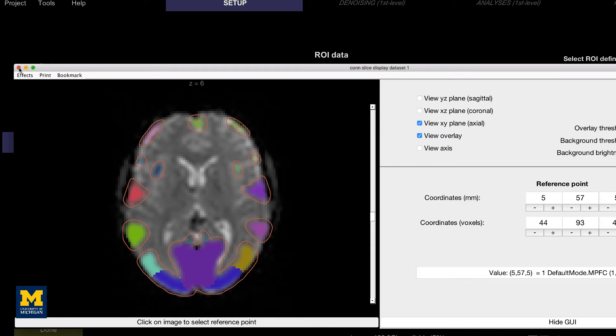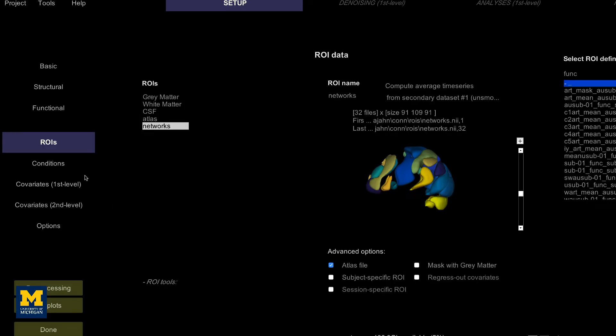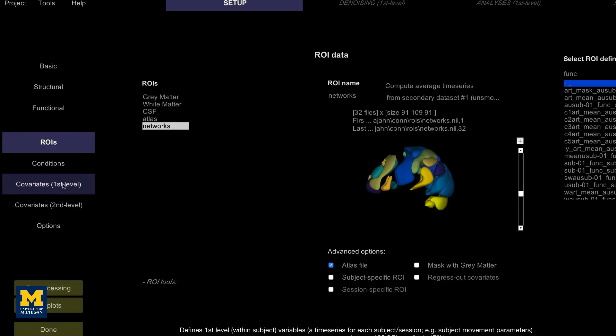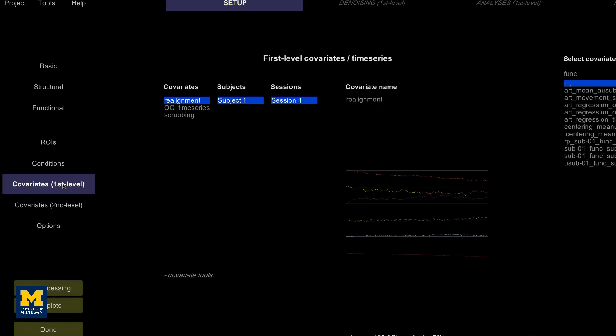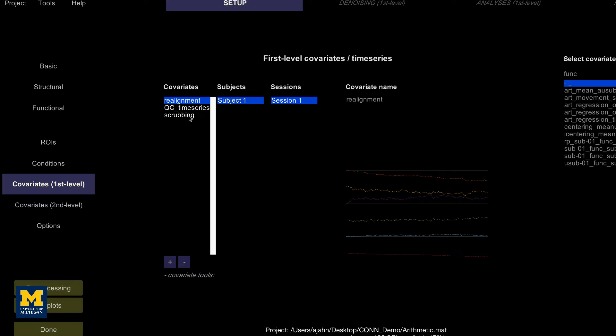Another output from preprocessing is nuisance regressors or covariates, such as motion, that we want to disentangle from the signal we are interested in. Clicking on covariates first level reveals three covariates that have been generated by default: realignment, QC time series, and scrubbing.